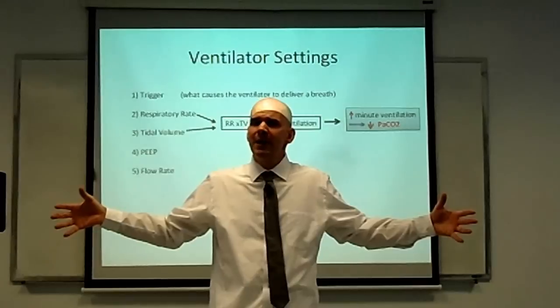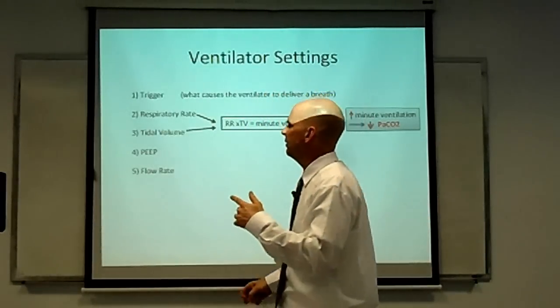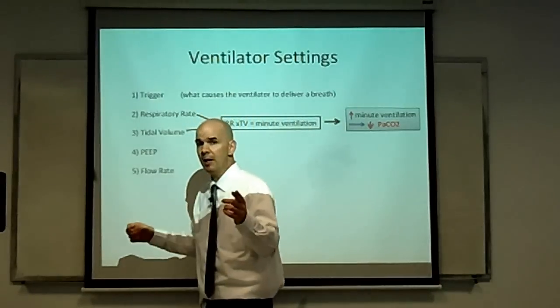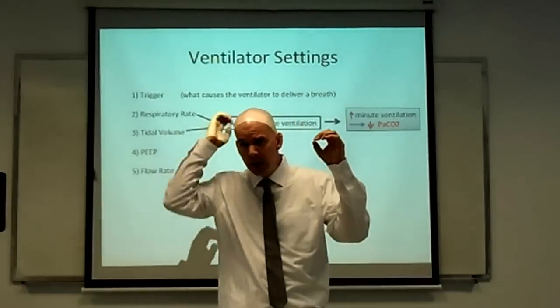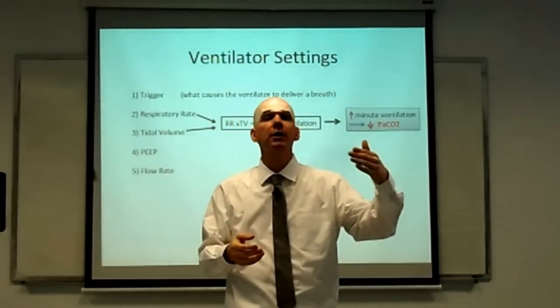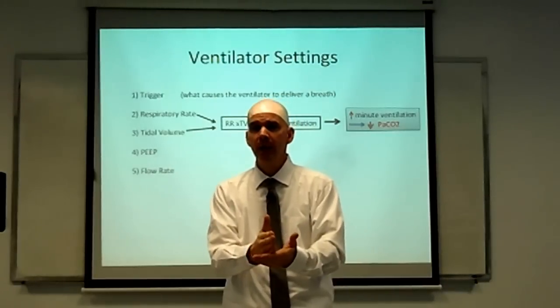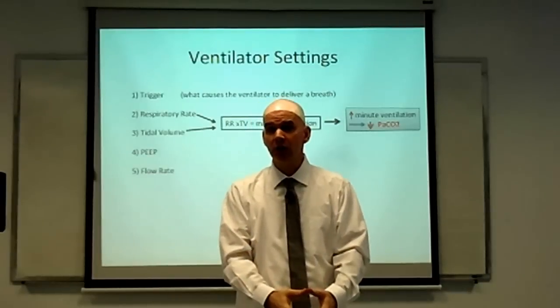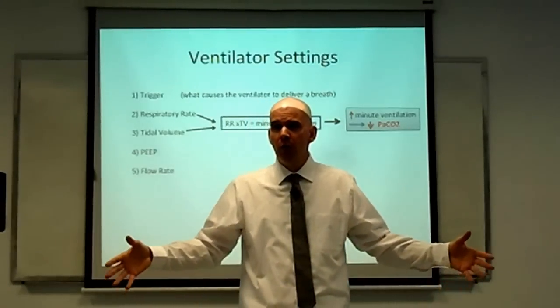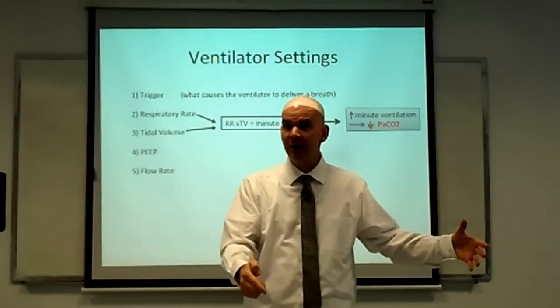It took a long time, and that's a problem, because if the inhalation takes a long time, I have less time left over for exhalation. Remember, we're working at a set respiratory rate. We're on a clock here. Say I'm working at a respiratory rate of 15 per minute, I've only got 4 seconds total for each breath. If the flow rate is slow, making the inhalation take a long time, then there's less time left over from that 4 seconds for the exhalation.